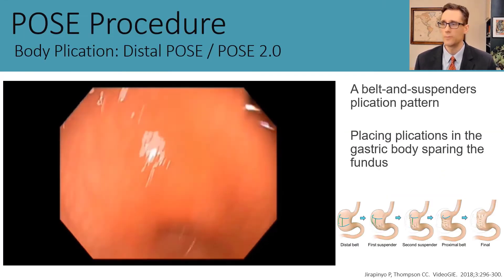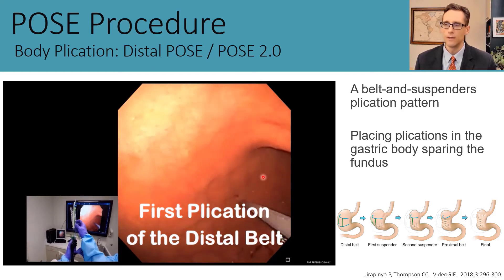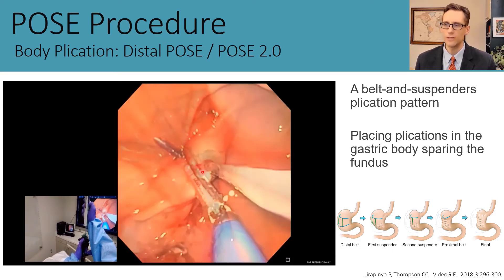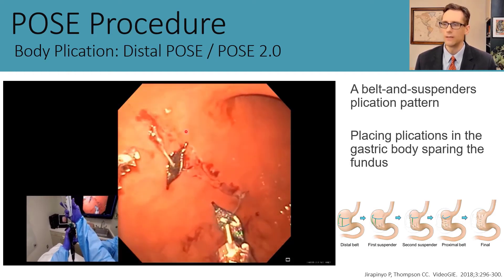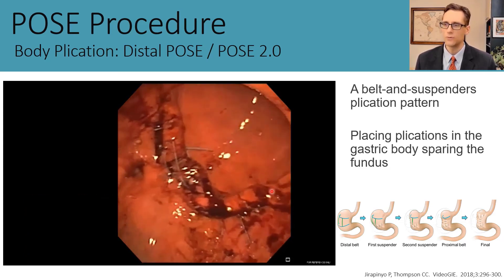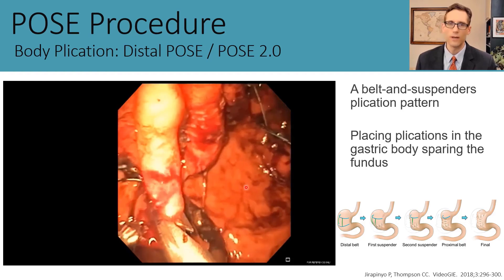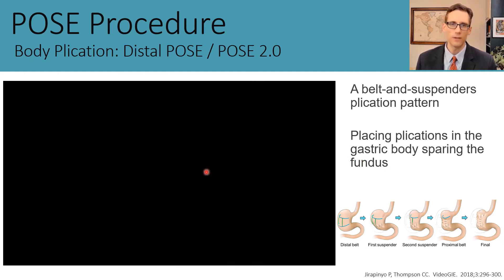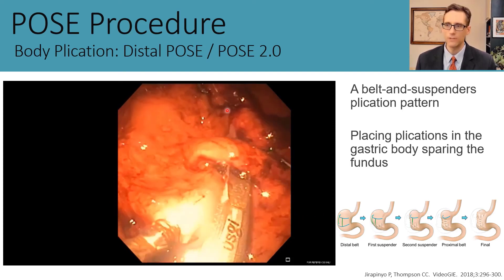Here we see the second version of the procedure, distal POSE or POSE 2.0. Starting with a normal-looking stomach, we begin by working on the distal stomach near the incisura. The first set of plications aims to reduce the width of the stomach—we call these the distal belt plications—placed perpendicular to the greater curvature to reduce width. Then we perform suspenders, running along the greater curvature longitudinally to reduce the length of the stomach.